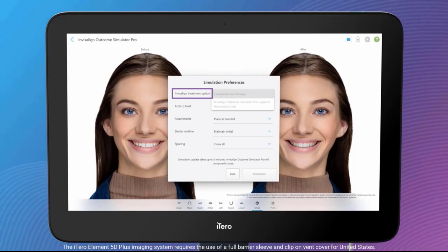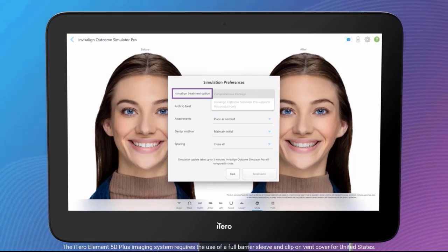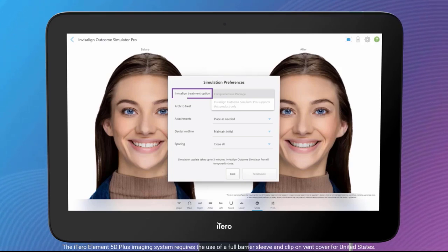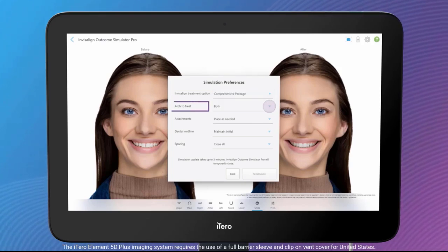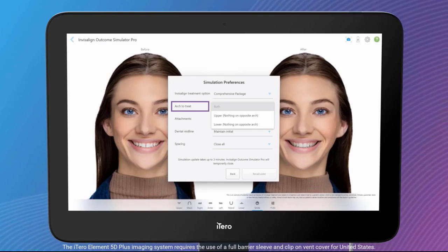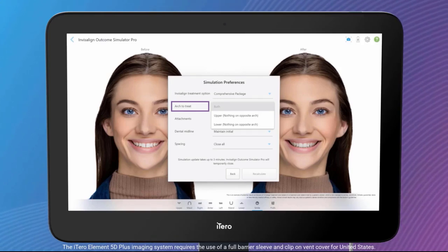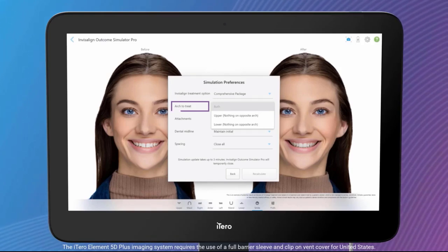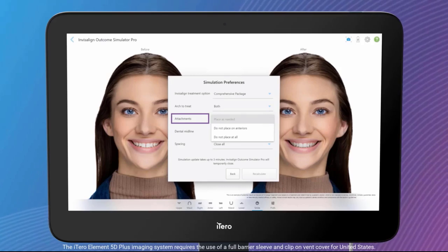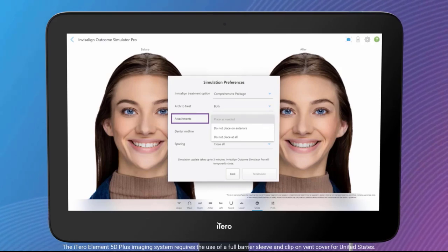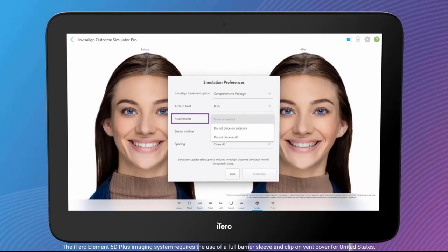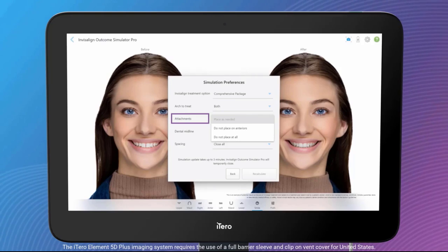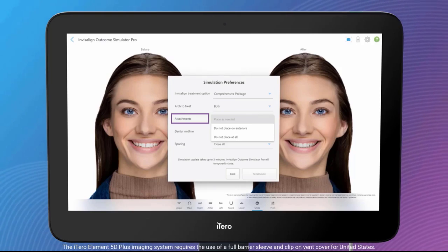The list of products depends on what's available to you in your market. Arch to Treat: choose which arch to treat — upper, lower, or both. Attachments: choose how to place attachments, either as needed, not on anterior, or not at all.